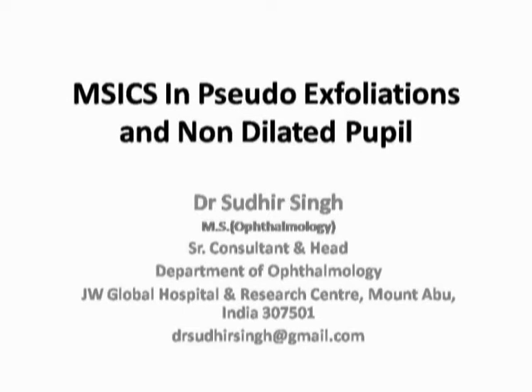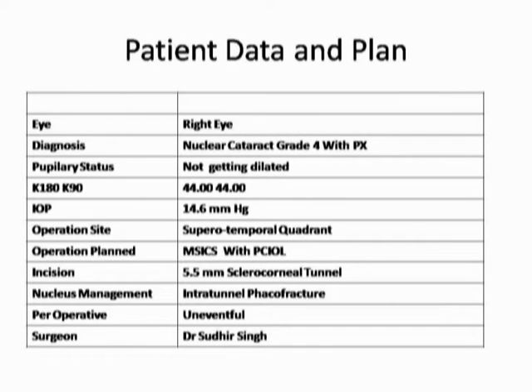Hi, I am Dr. Sudhir Singh. I am going to demonstrate the Intratunnel Phacofracture Nucleus Management Technique of Manual Small Incision Cataract Surgery in Pseudoexfoliation and Non-Dilating Pupil.